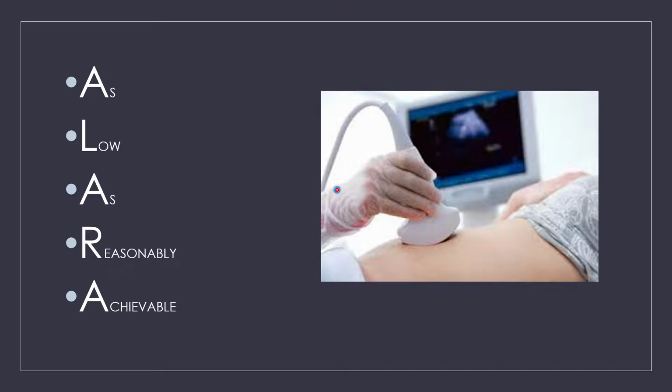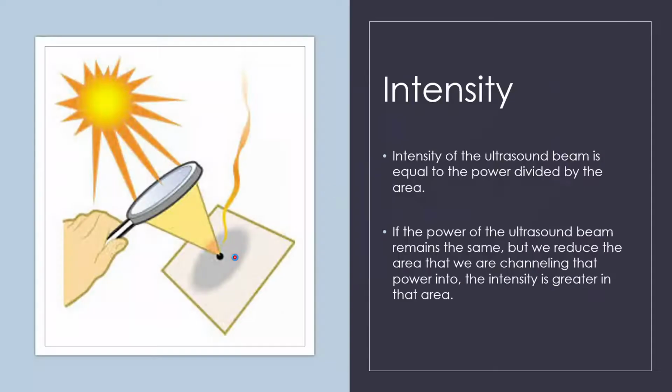Now, even though ultrasound is completely safe because there's no proven bioeffects yet, we still want to be using it prudently, because we are scanning an area that is very small and also has lots of developing cells within it, right? The embryo, that little baby in there, has got lots of tiny cells that are rapidly developing. So we want to know what we're doing, okay?